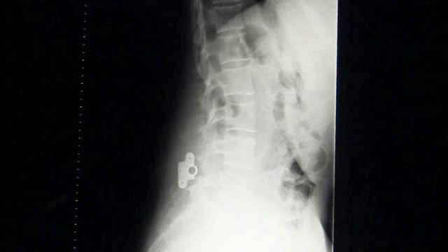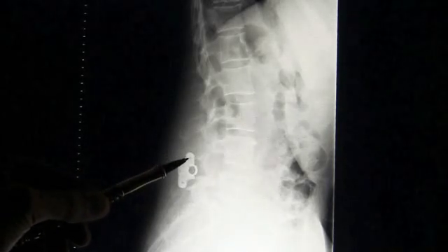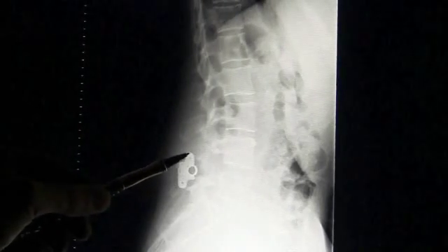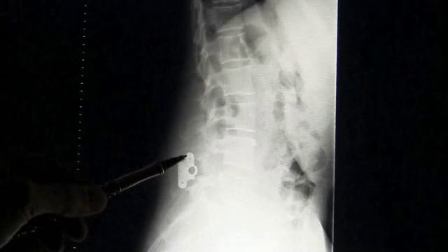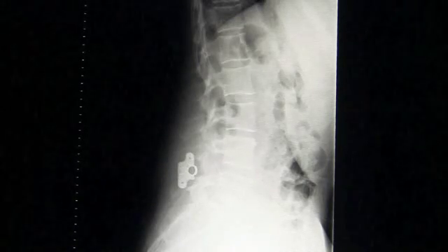This is a post-operative x-ray of the device in place, clamped across the spinous processes of L4 and L5. This allows stabilization while the fusion takes place. The patient is up and moving in a brace and can return to driving and office work within seven to ten days, using the brace to avoid bending, twisting, and lifting for the first eight weeks.